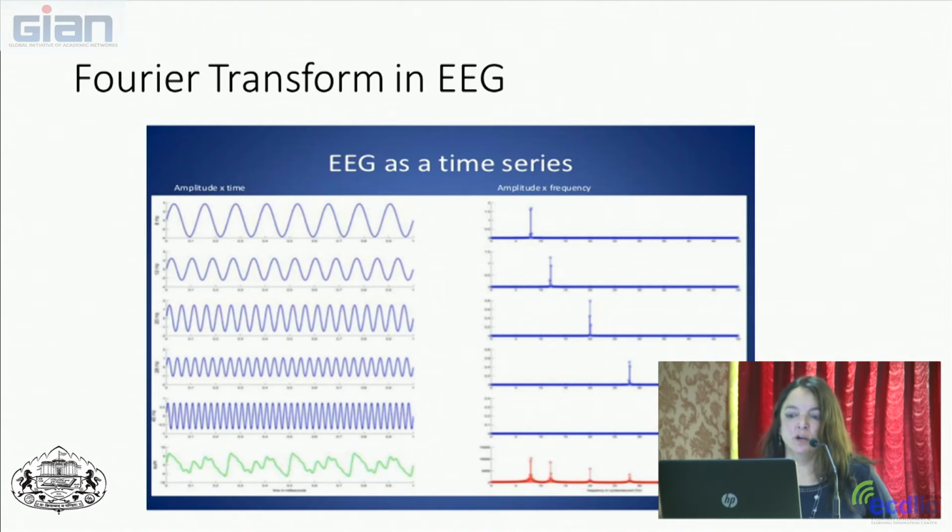And if you would put these all together and get the signal at the bottom, then you could represent this bottom signal of how much of each of these waves are embedded in this signal.